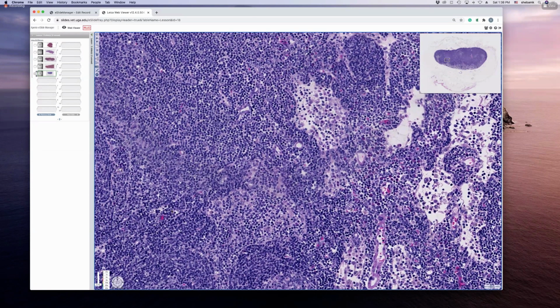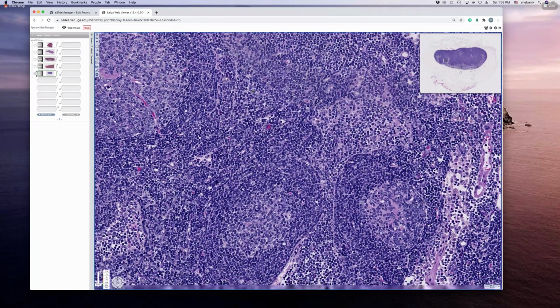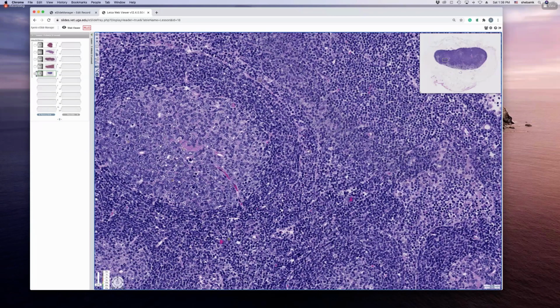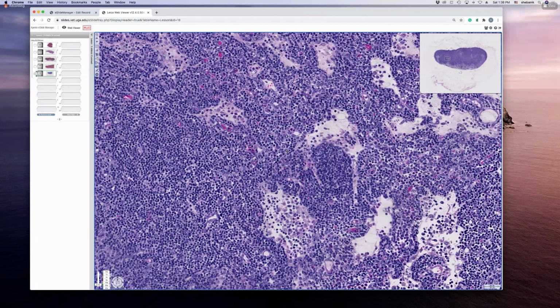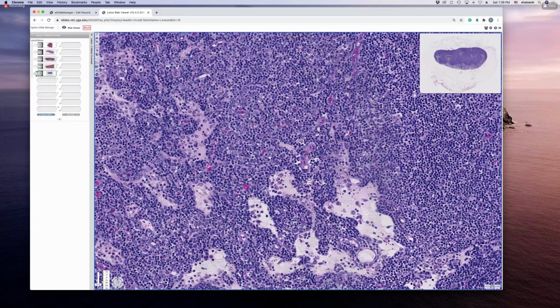The lymphocytes tend to escape out from the blood circulation through these high endothelial blood vessels. So you should know that these lymphatic organs have these specialized vessels with the specialized endothelium. High endothelium is what we call them. The endothelial cells are more prominent. They don't have a flat nucleus like squamous cells, but these cells are a little taller. So high endothelium is what we call them.